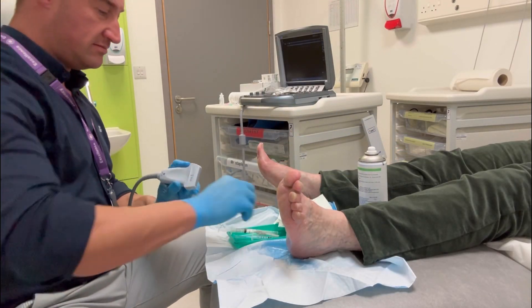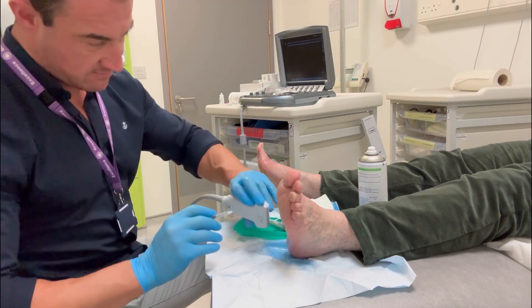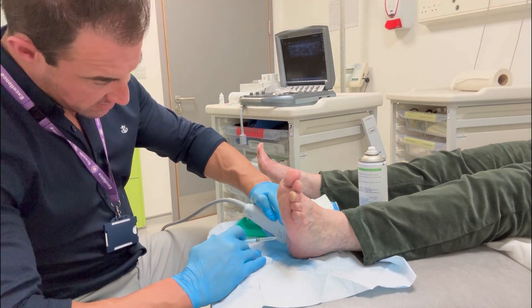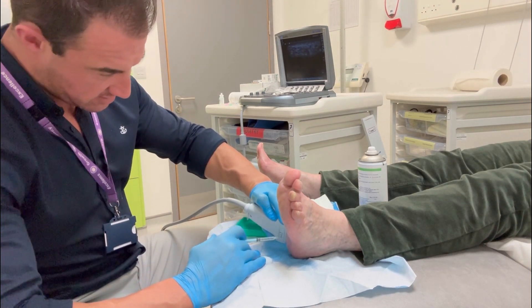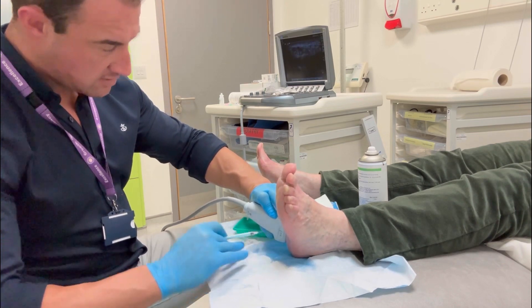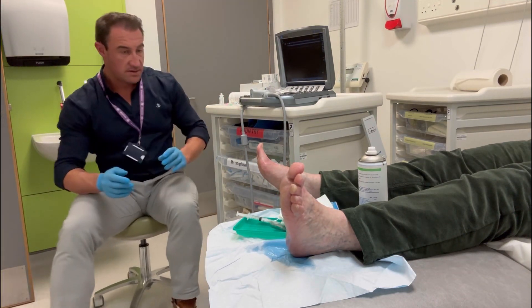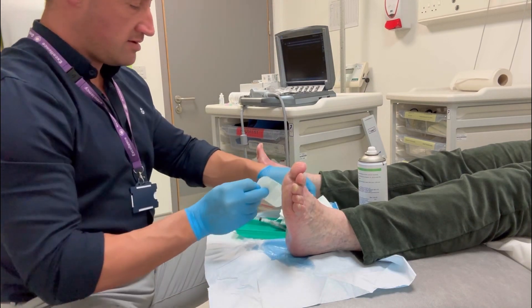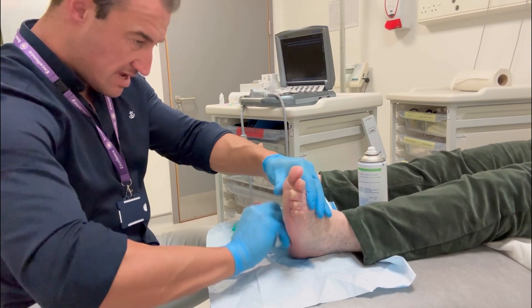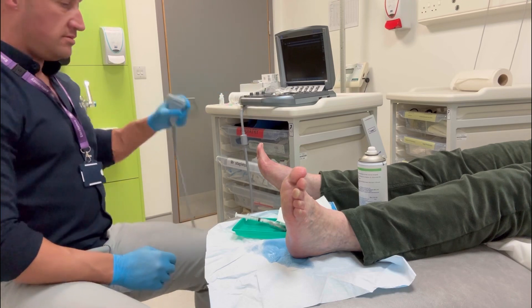Welcome back for another one of my pediatric sports medicine treatment videos. Here we are performing an ultrasound-guided corticosteroid injection for plantar fasciitis. I perform this injection in two parts — first with local anesthesia, using a superficial 30-gauge needle with a low dose of lidocaine. This numbs a small area of the sole of the foot, which makes the second deeper injection much more comfortable.